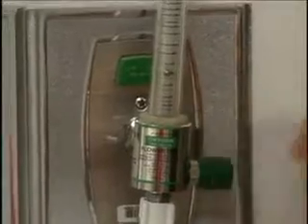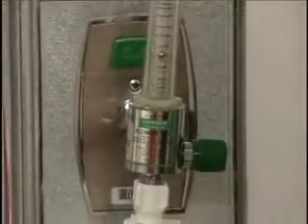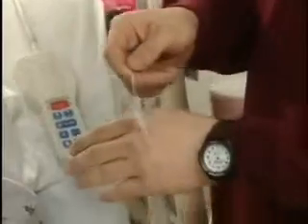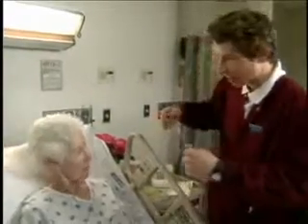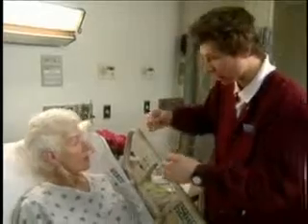Now adjust the flow rate to the ordered amount. 4 liters per minute. And now I'll just check for adequate flow. Okay. Feels good. Okay, Mrs. Keene, I'm going to put this on you now, okay?